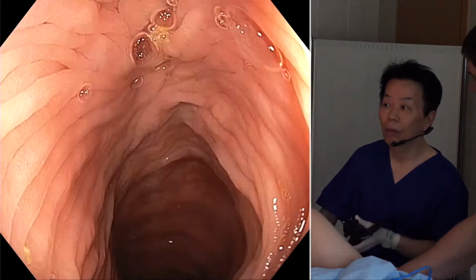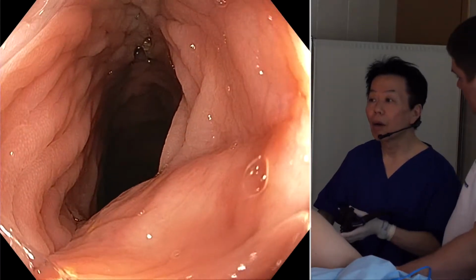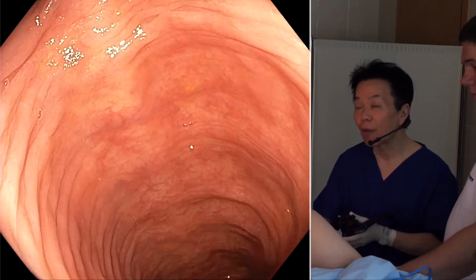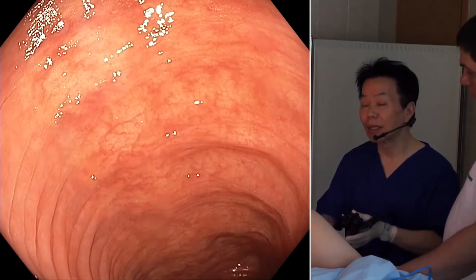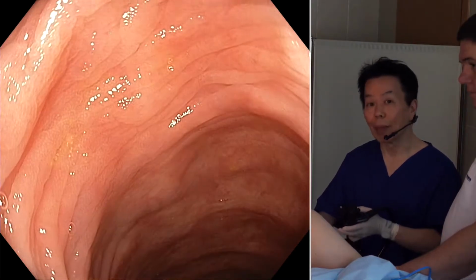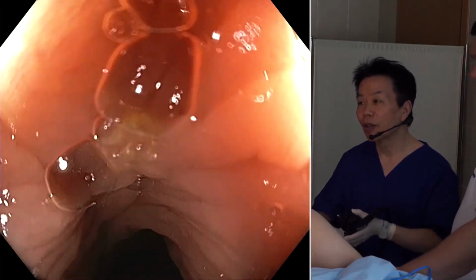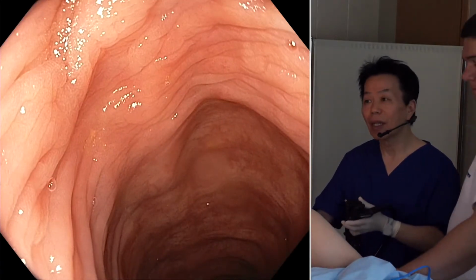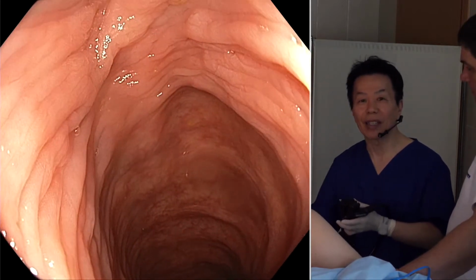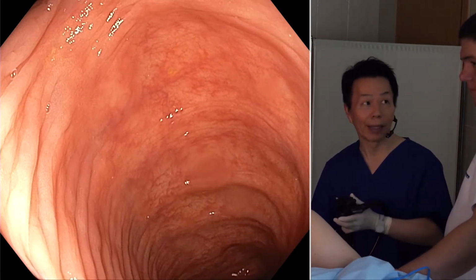Do you perform ESD procedures with sedation or without sedation? Almost always with sedation, but usually awake sedation with, as I said, pethidine and midazolam or diazepam. Just a small amount. So the patients are usually a little bit awake, at least for colorectal ESD. For upper GI ESD, we need to sedate the patients deeper than colorectal ESD.